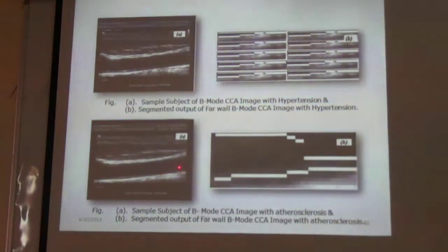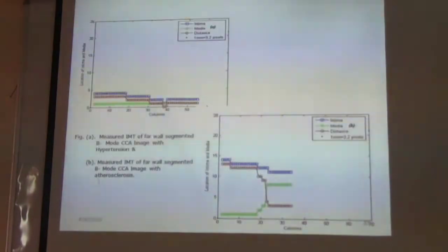Could you able to view this one? Some additional diseases are located here. Yes, in this lumen. That segmented information is in this. You see that bound of thickness. Okay, this is an atherosclerosis. But for this dynamic method, it can't support that much. Okay, while viewing itself, it won't show that much thickness difference. But in active contour, you can get clear information.